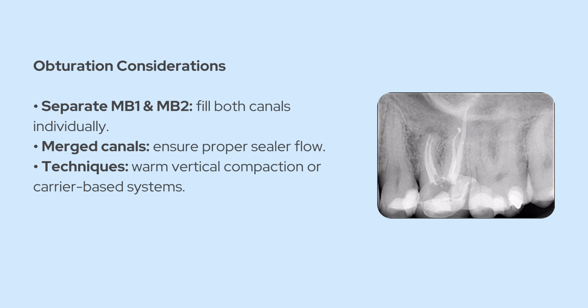So that's the overview of the clinical importance of MB2 canals, from the consequences of missing them to the diagnostic tools and the step-by-step approach to finding and treating them.